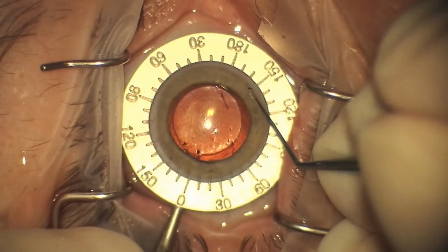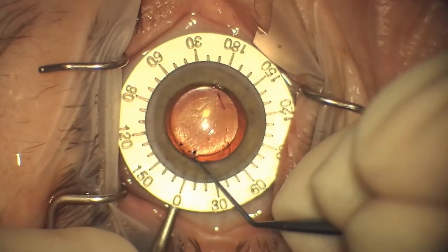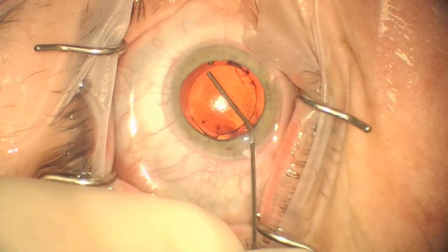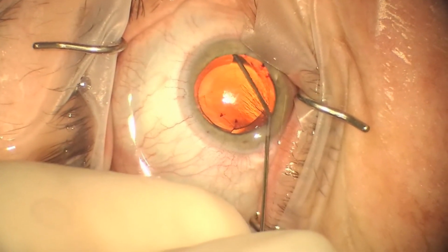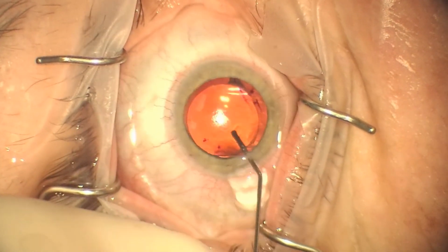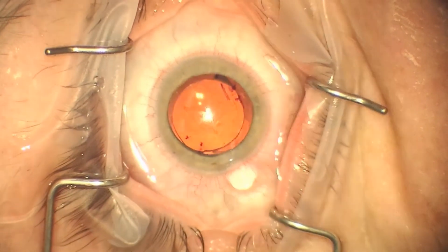Once we make our initial marks, then we find 30 degrees away and mark that precisely. One thing that's nice about marking the current position and where you're going to mark to is that you don't have to take into account the effects of cyclorotation. Clearly you would have to when you originally implant the IOL, but not once it's in place.